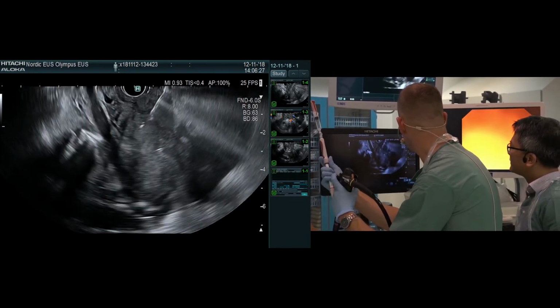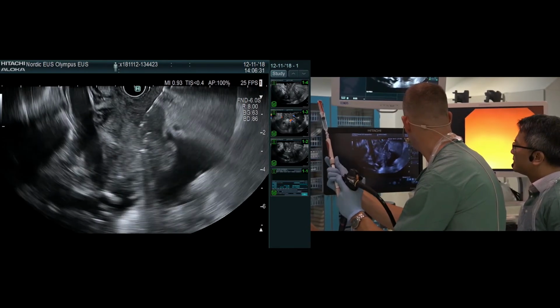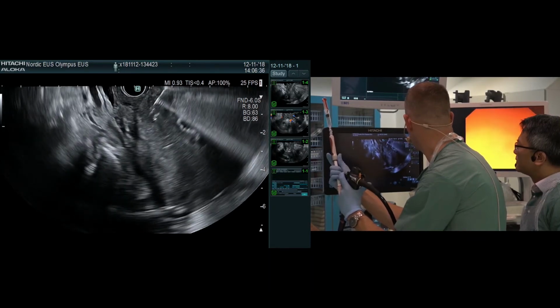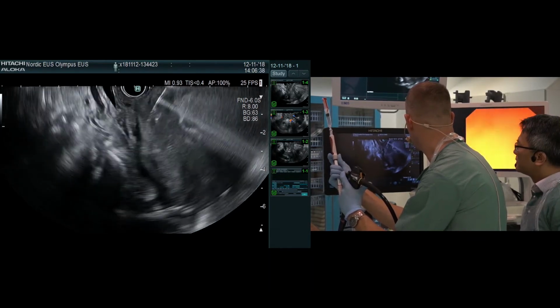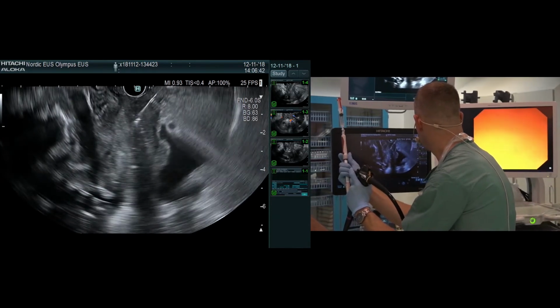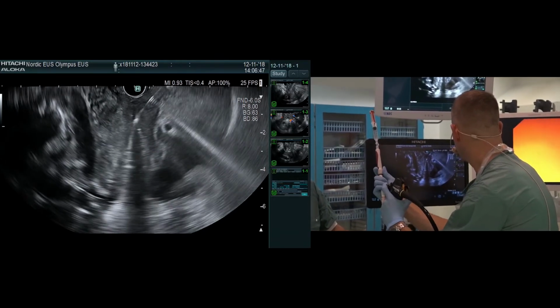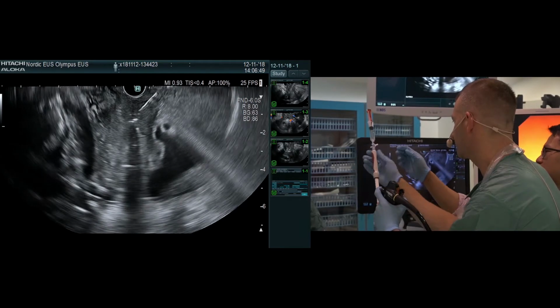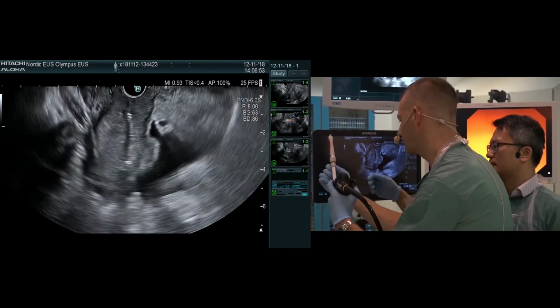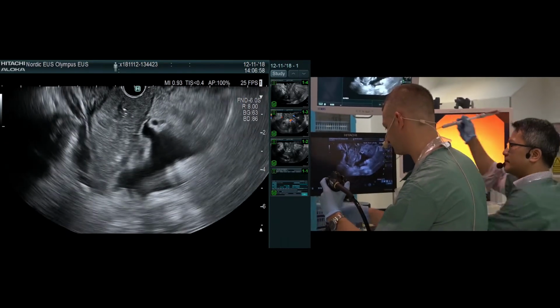By changing the wheel, the big wheel changes the direction of the needle going in, going from one side to the other. So I think we are fine now. We've covered most of the lesion, so we turn this off, disconnect, take the needle out, lock, unscrew, and we are finished.